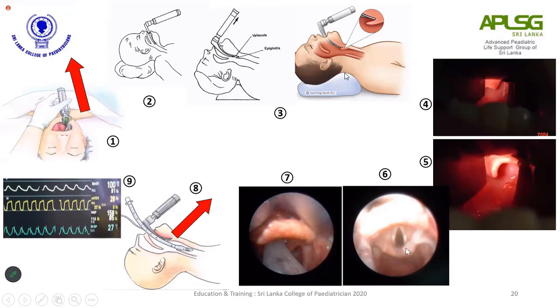Once you see this, you need to start intubating using the correct size endotracheal tube. And you slowly advance it further down while withdrawing the laryngoscope outwards. Of course, this is easier said than done, so that's why it's always important to practice this skill whenever possible.